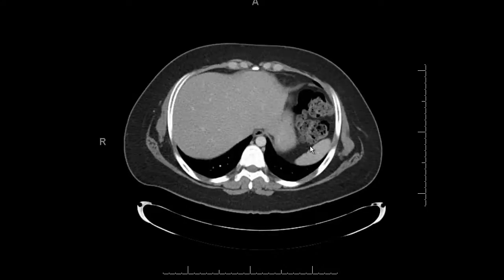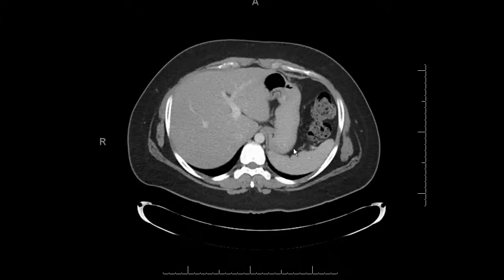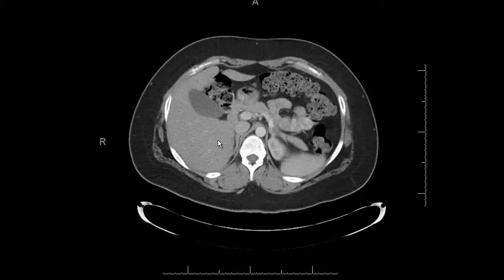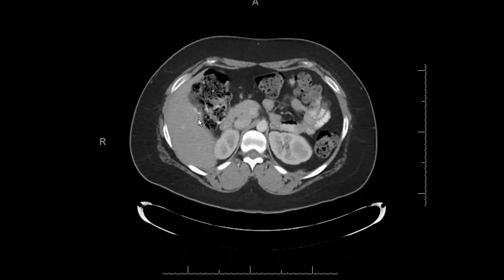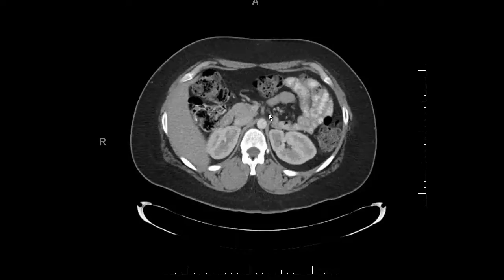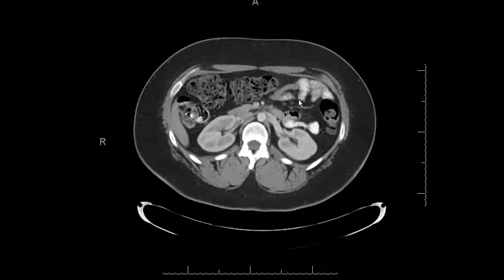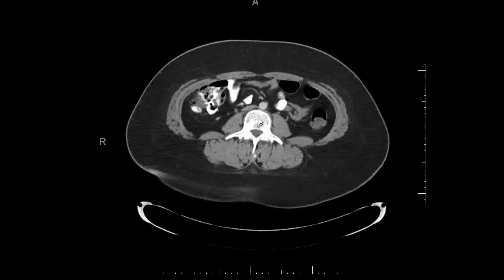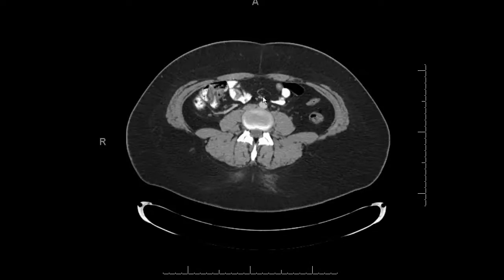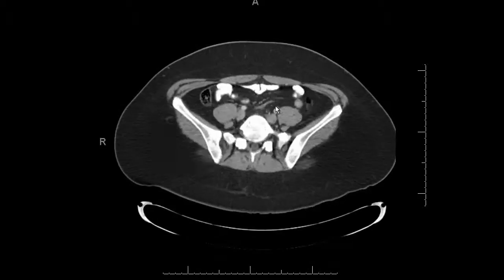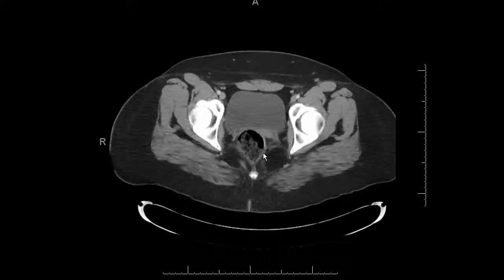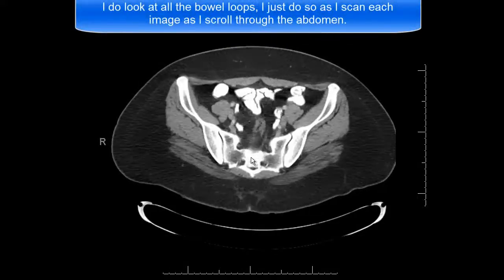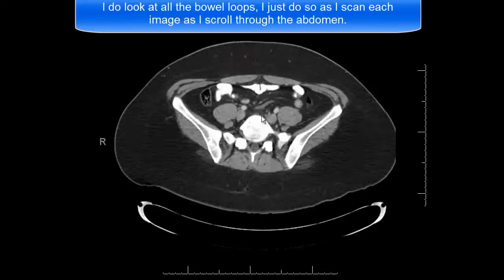For the remainder of the small bowel, I don't follow each loop individually — I just look through the mesentery, carefully scrolling down and looking at bowel loops for wall thickening or any lesions. I focus on the mesentery and look for lymphadenopathy. Once I've gone through the small bowel, I'll look at the large bowel — you can scan through the mesentery, but sometimes it's worth following the large bowel specifically to make sure you don't miss a mass.